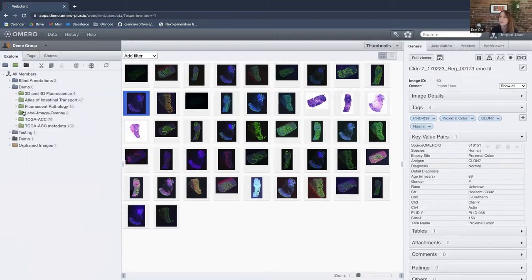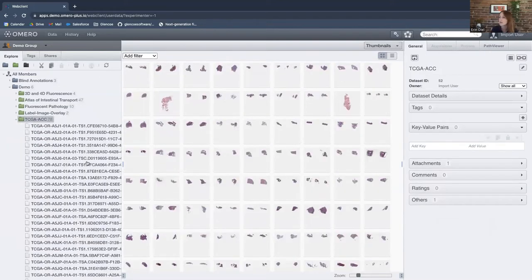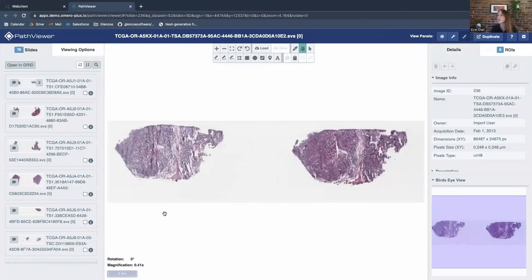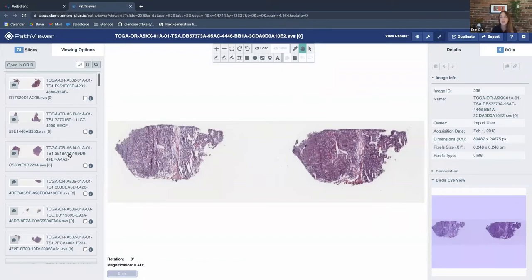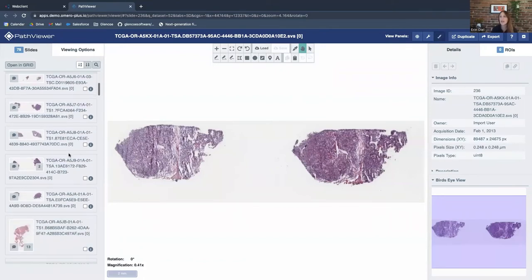We also have a dataset from the Atlas of Intestinal Transport from Harvard Medical School. On this image we similarly have tags and key-value pairs, more experimental in nature — for example, the antigen used on a particular sample. That reflects a discovery-based workflow where you might be staining tissue sections with a variety of markers. You can actually Google the Atlas of Intestinal Transport — it's a beautiful reference dataset. Now I want to open one of these images in the viewer; I'll choose one from the Cancer Genome Atlas.